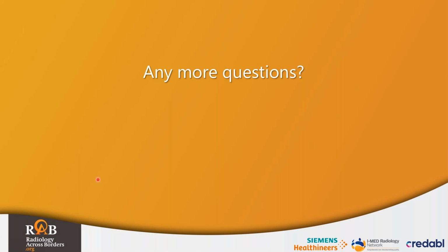Depending on your scanner, it may not use a baseline. I certainly know GE don't use a baseline, so it's just a true 150 Hounsfield units, which may be the case in that scenario. The other point is it's a way to control the phase timing. If your doctor says that everything is too early, you can increase the Hounsfield units to push out that timing. It's probably not a way that I would suggest doing, because you can change other things before changing the trigger.